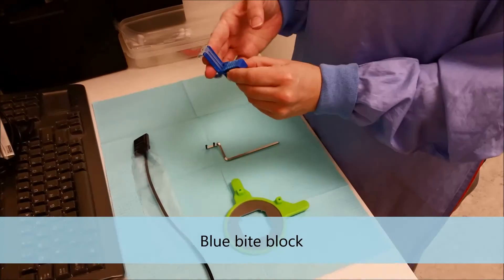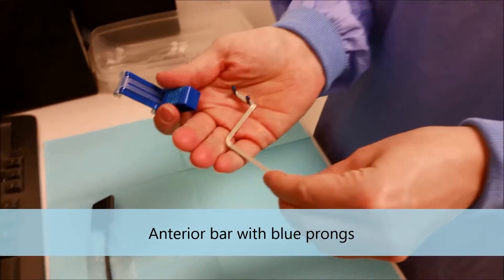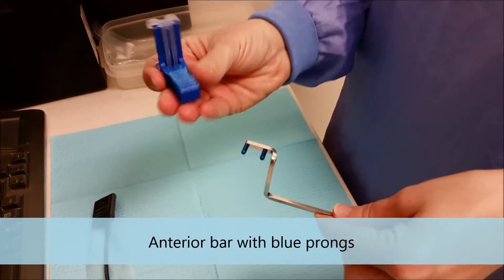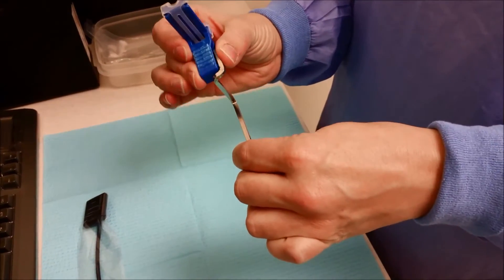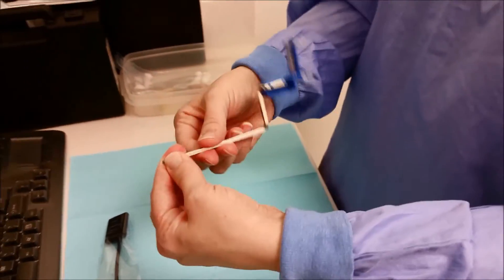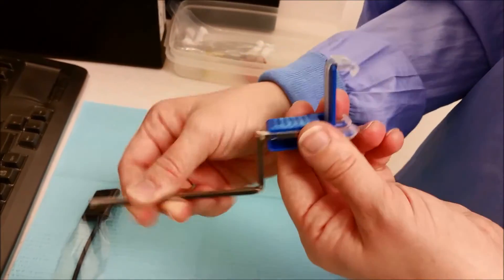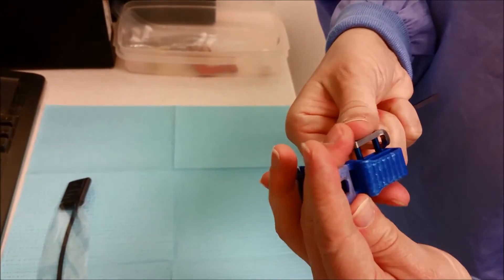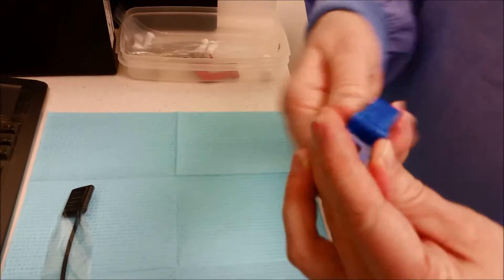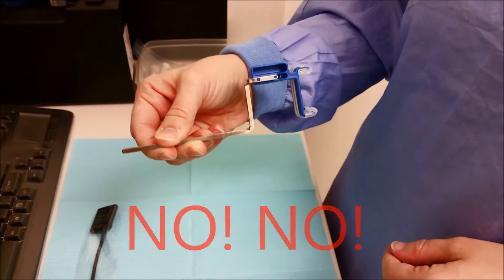We're starting out with our anterior bite block and our anterior bar. It's nice because it does have the blue bite block. We're going to go ahead and place the pegs in. When you're looking at your anterior bar and bite block, it's kind of like you're going up some stairs. I'll show you how not to do it — you don't want to make a house or a box.